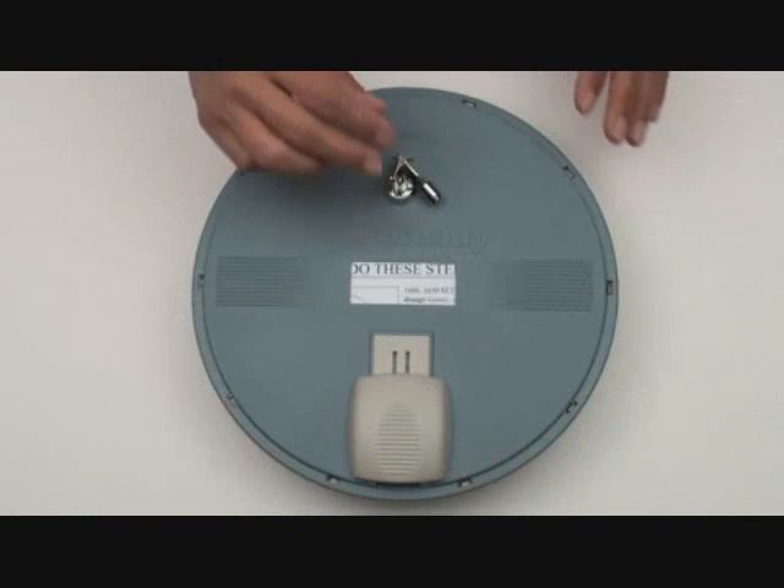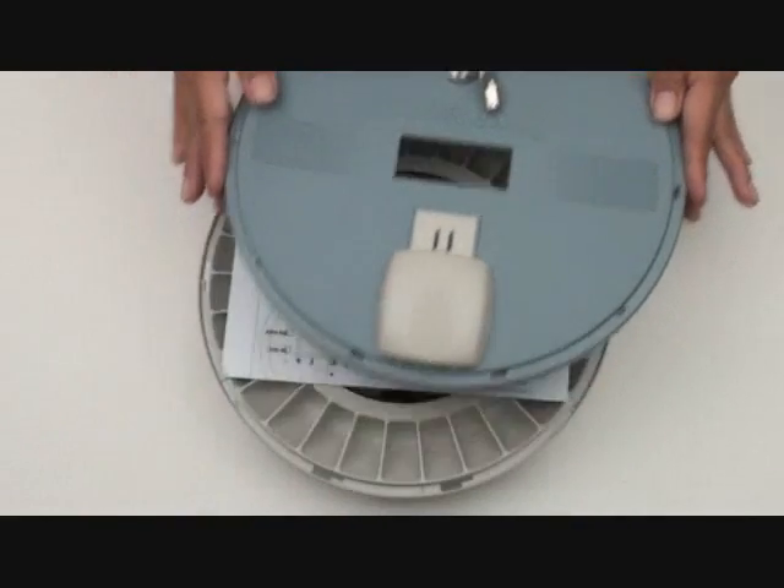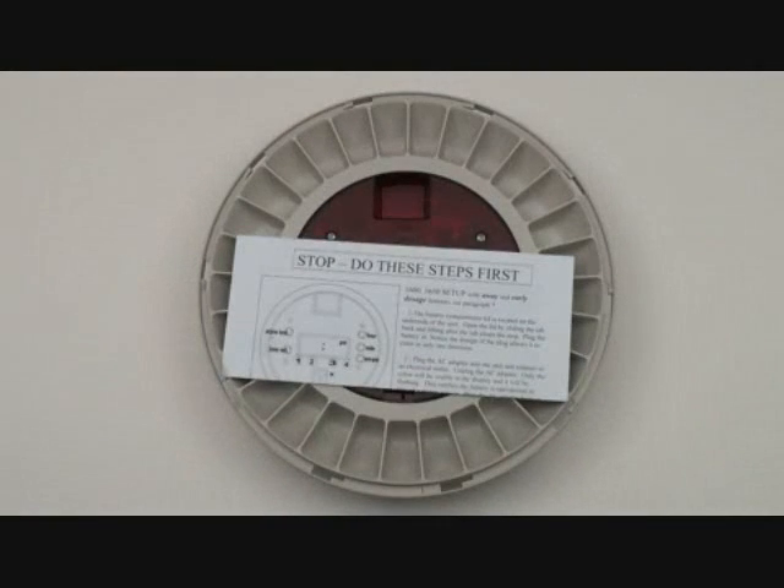Unlock the unit and you will find the instructions directly under the cover. Please read these completely before proceeding.